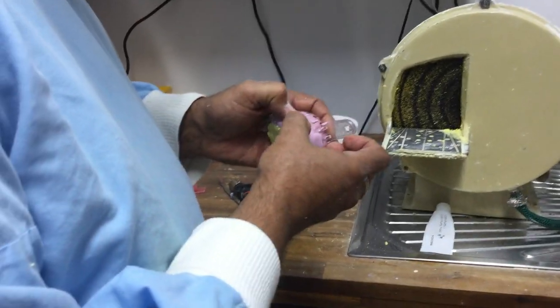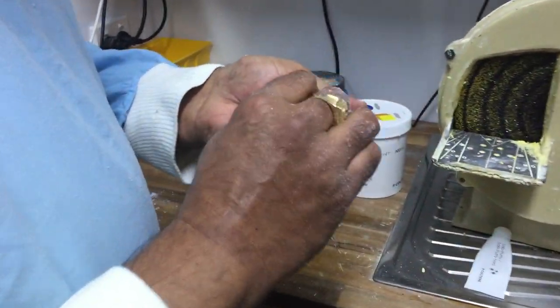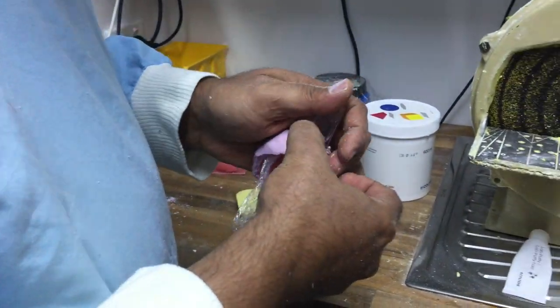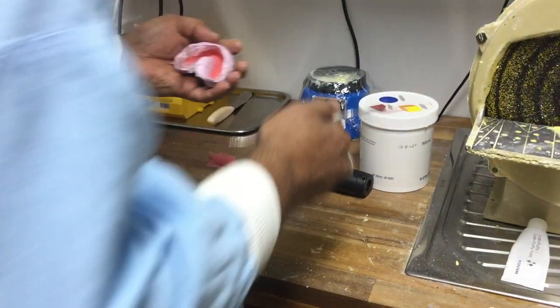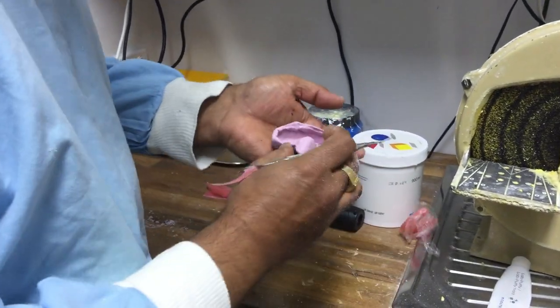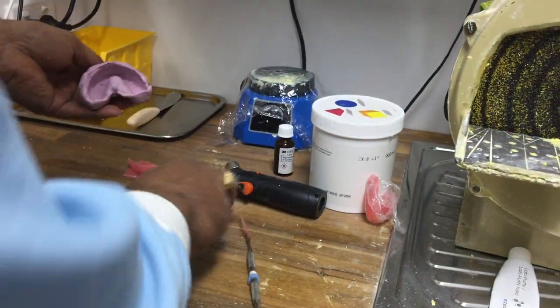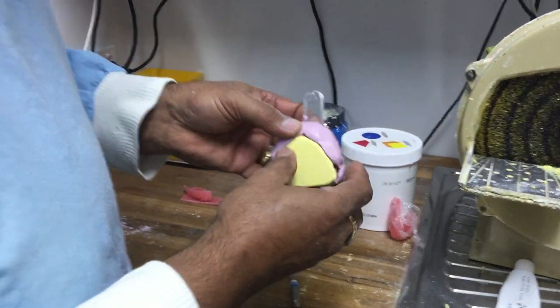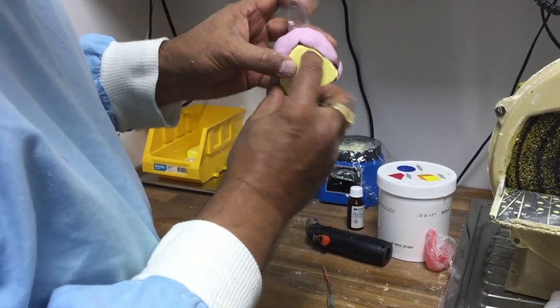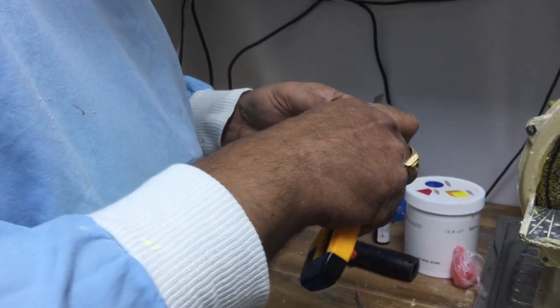This one is almost ready. It came out quite easily. There's a nice void in there. I'm doing a heavy wash material in here, so that's a nice void to receive it. I'll now make sure it doesn't go past the marked lines, so I'll trim it up a little bit using a box knife.